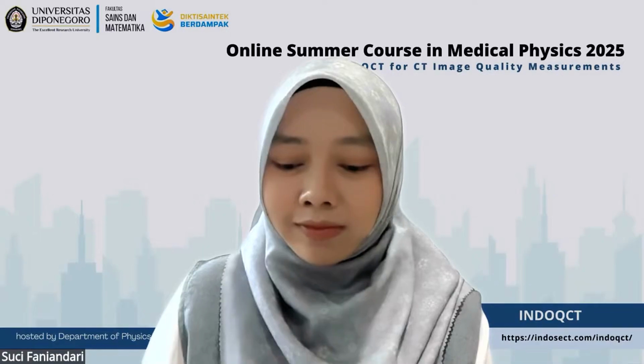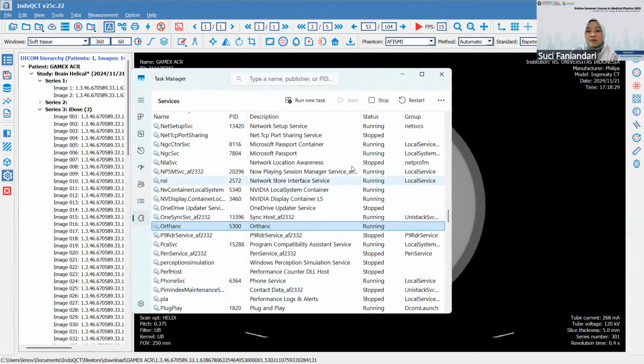Maybe I can share my screen once again. Okay. If you see the state is not running, the Orthanc service, you can manually start the service, just like this. Start the service to manually start the Orthanc service. Yeah, we can see here that it is already running in the background.